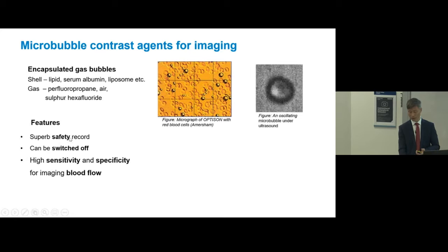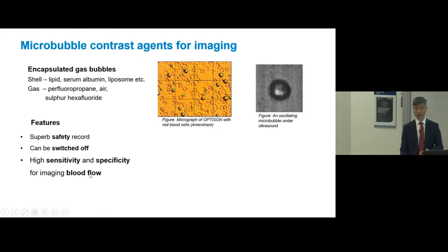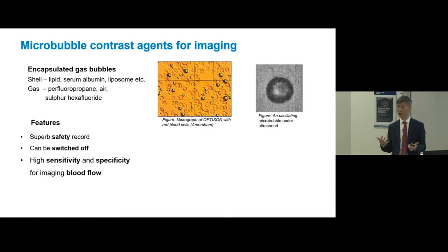It has lots of nice properties, including safety. It can be switched off because bubbles can pop. I'll touch on that later. You can image them very sensitively and specifically, so basically if you introduce them into the blood flow, then you can see everywhere in the body. So for the rest of my talk, I will really focus on this blood flow imaging.